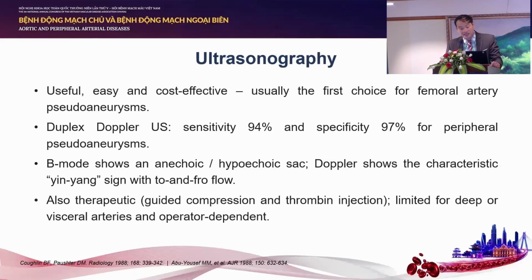Ultrasound is useful, easy, and cost-effective. Ultrasound sensitivity is more than 90% and specificity nearly 97% for peripheral pseudoaneurysm.